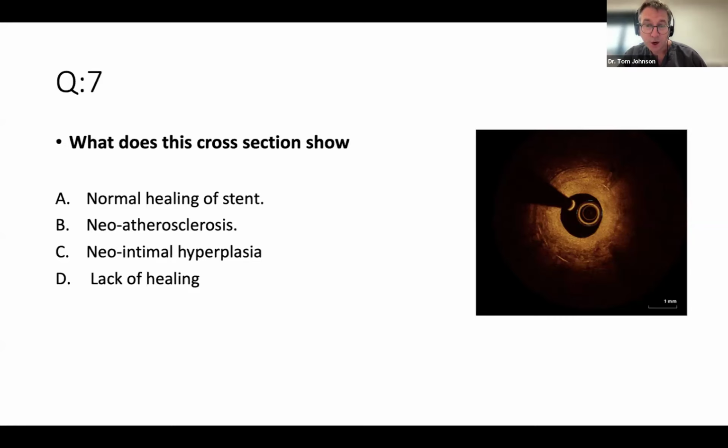And then what you can see confidently is this very homogeneous, very uniform signal with high reflectance. So it's bright yellow, but you can see deeper wall structures. So you're all absolutely right to highlight that there's intimal hyperplasia. This is classical fibrous tissue. And because this allows the light to penetrate, what you can see behind are stent struts.